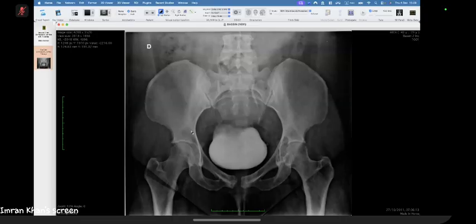So I would evaluate the patient for breast primary if it's a female, or it can be from the lungs, kidneys, or thyroid. However, besides metastasis, I would also keep myeloma in my differential. For that, I would like to check if the patient has undergone any screening for that.